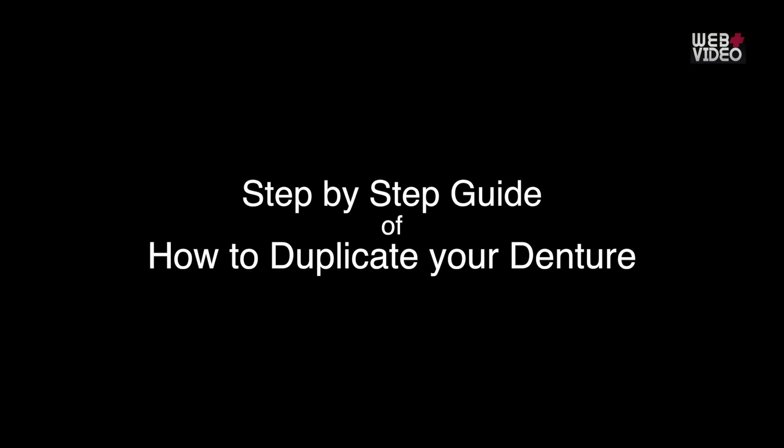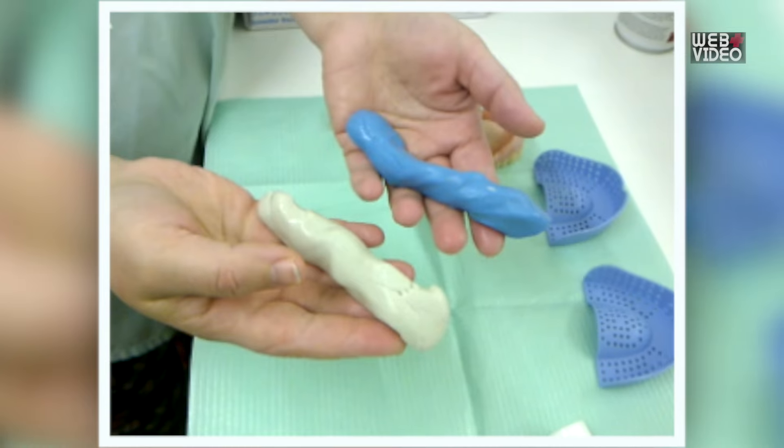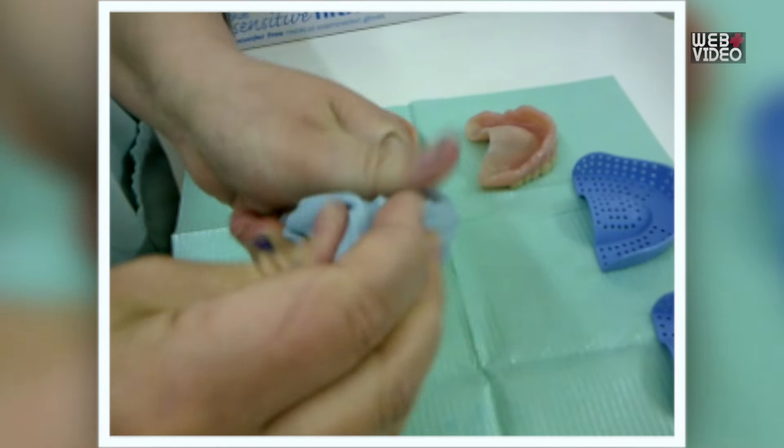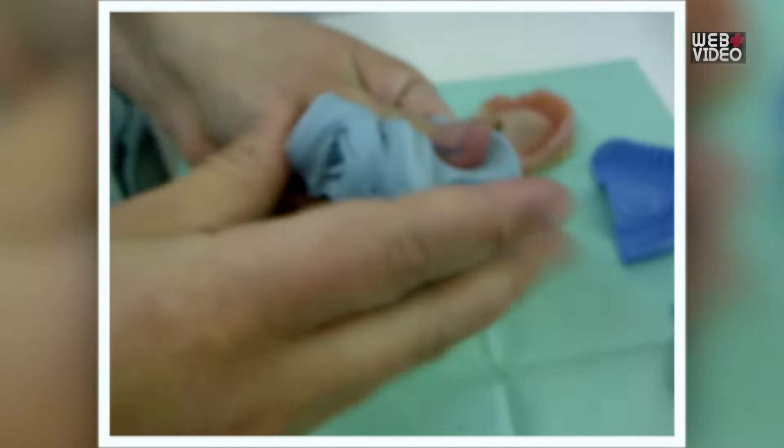A step-by-step guide of how to duplicate your denture. Step 1: Mix the white and blue parts of the lab putty which you received in the pack evenly. Ensure that it is all one colour.